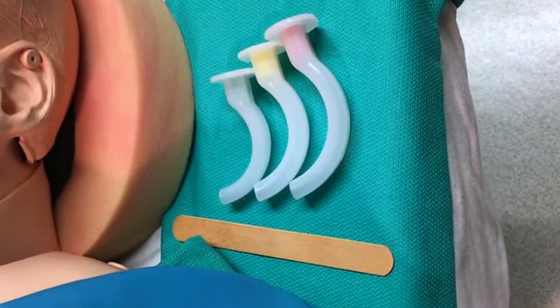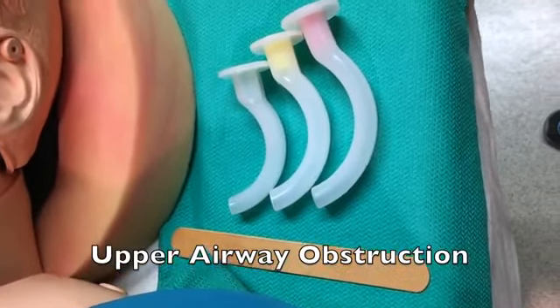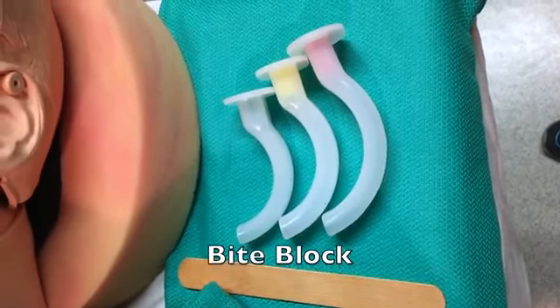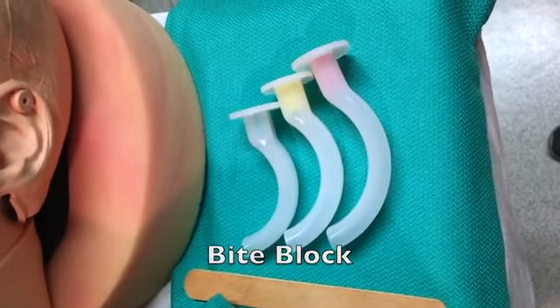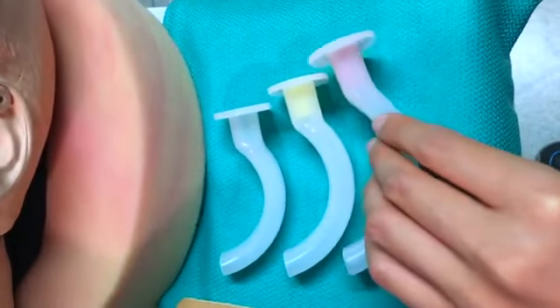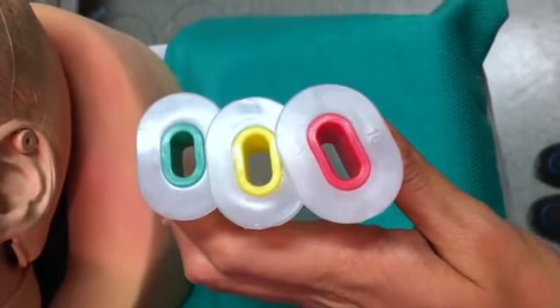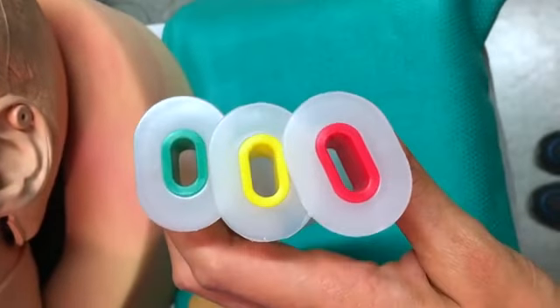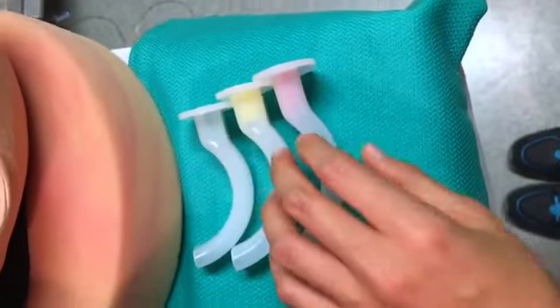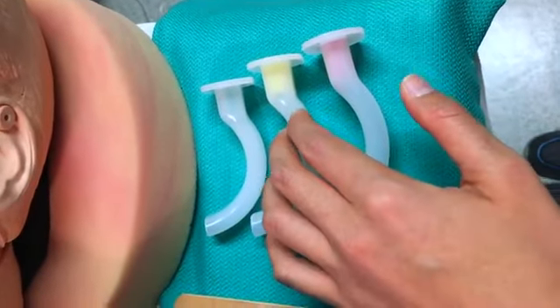I'm going to be talking a little bit about oropharyngeal airways, or oral airways as they are called. They're usually used for upper airway obstruction, absent airway reflexes, like when the patient's unconscious, or as a bite block, especially if they're biting down on their ET tube. You can see there are 3 different sizes. This is an 8, a 9, and a 10. They're also color coded: green, yellow, red. I like it because it's like a stoplight. Green is go, yellow is slow down, and red is stop. So it's an easy way to memorize the colors with the sizes. I think the average size is usually the 9 in the middle.